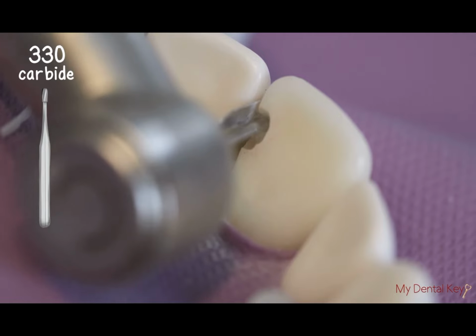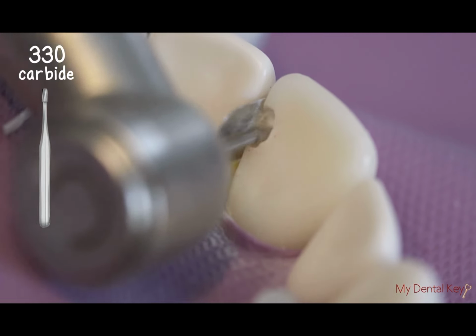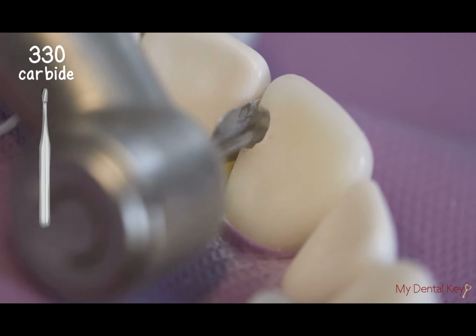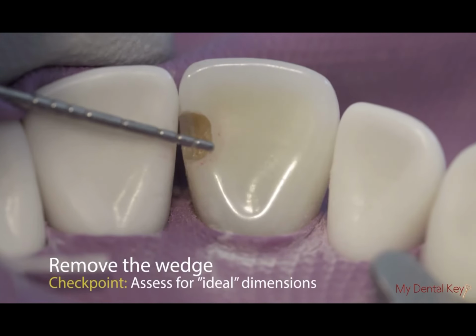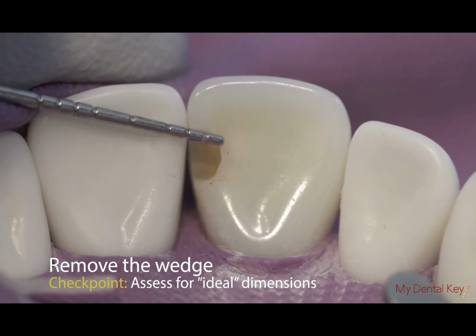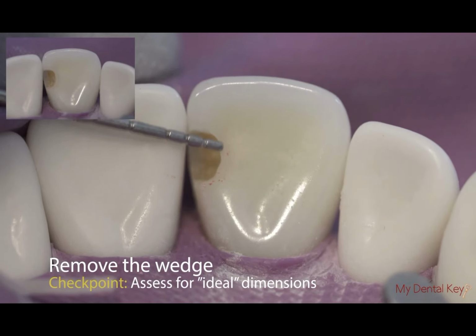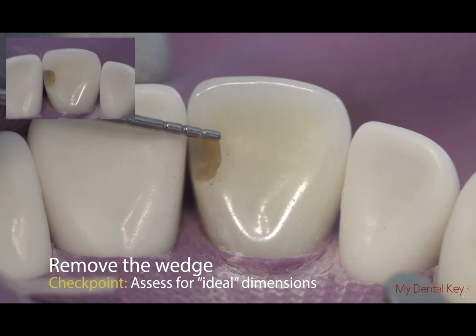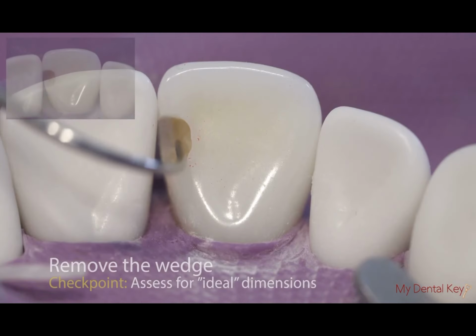Here we are using the 330 carbide burr because we are now in the dentin. The diamond 330 could be a little too powerful in the dentin. Remove the wedge to assess. Once the wedge has been removed, check your contacts, ensuring that the gingival contact is open, incisal contact is closed, and the facial is less than 1 millimeter broken.